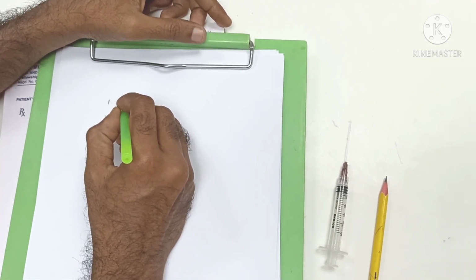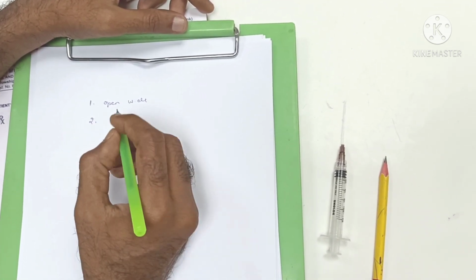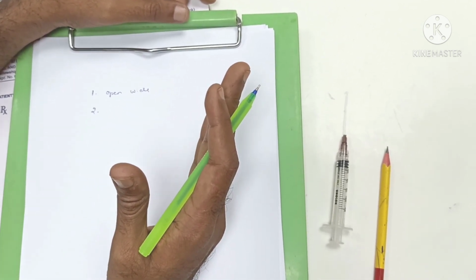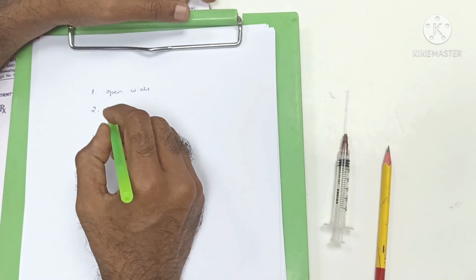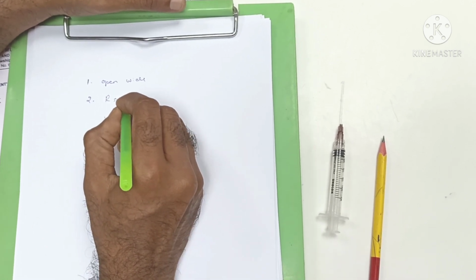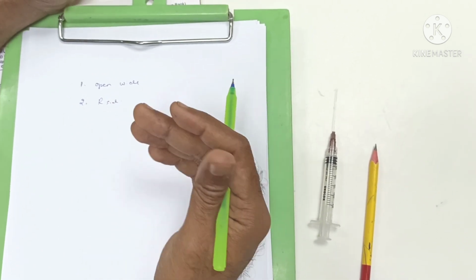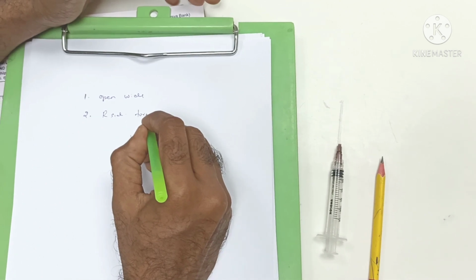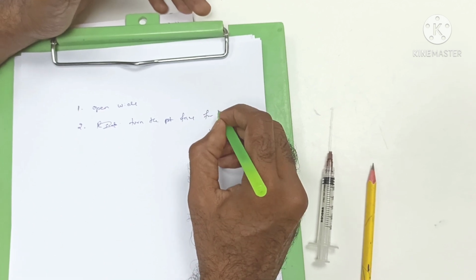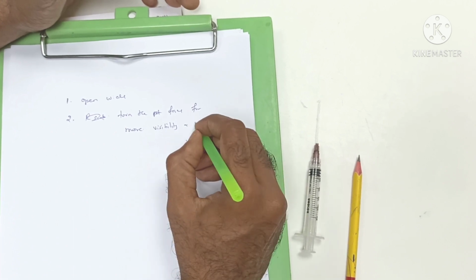The first thing is to ask the patient to open the mouth wide. The second thing is to ask the patient to move the face towards your side or away from your side, depending upon which side you are giving. If you are giving a right side block, ask the patient to move towards the right side. If you are giving a left side block, ask the patient to move towards the left side. So turn the patient's face for more visibility and convenience.